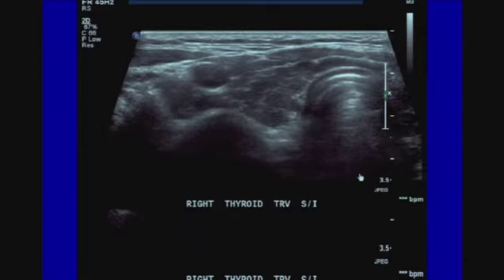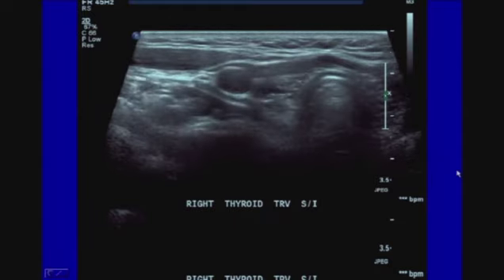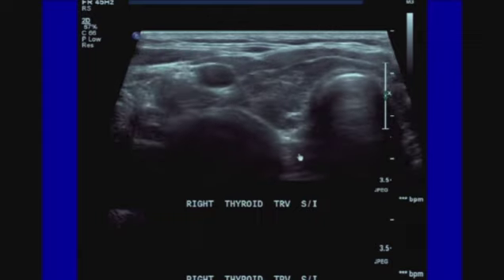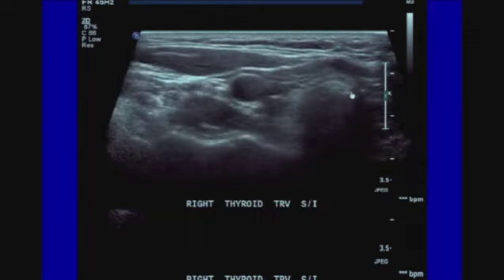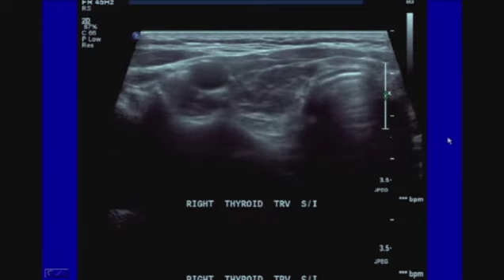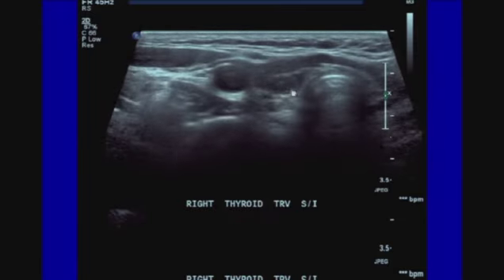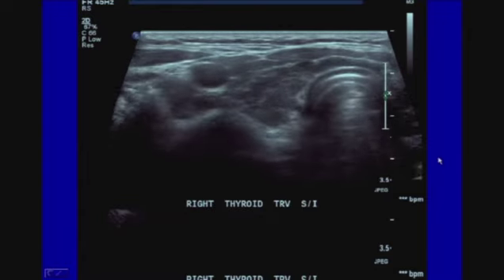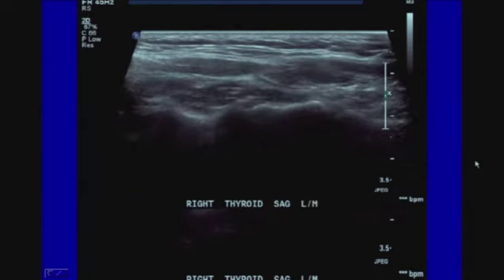If we look at this video clip here, in fact, I think this brings this out very nicely. We can see those white echogenic lines very clearly admixed with these hypoechoic areas. We can see the capsule of the thyroid is very irregular, and this is very typical of Hashimoto's thyroiditis. This gland, again, being normal in size, but one of the very prototypical features being these white areas of fibrosis as a hallmark in distinguishing this from some of the other diffuse thyroid processes.